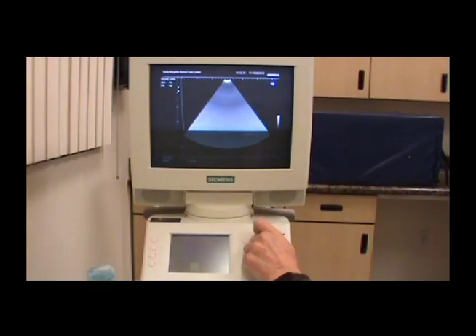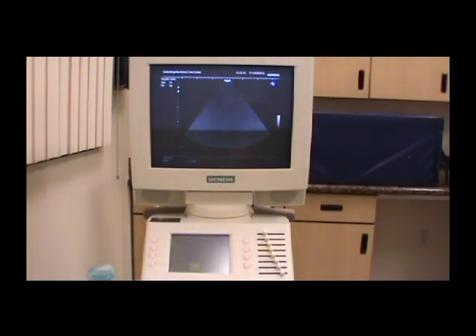The goal is to obtain a cardiac image which shows anechoic chambers filled with blood and clearly defined muscle walls. Once the TGC toggles have been set, the overall gain knob can be used to increase or decrease gain, affecting the entire ultrasound screen.